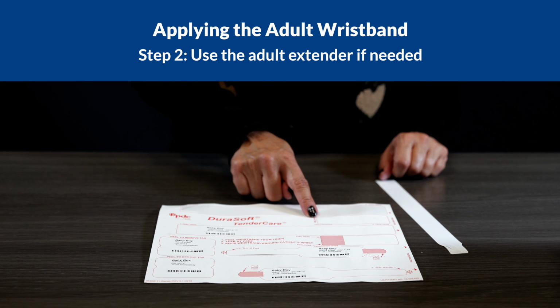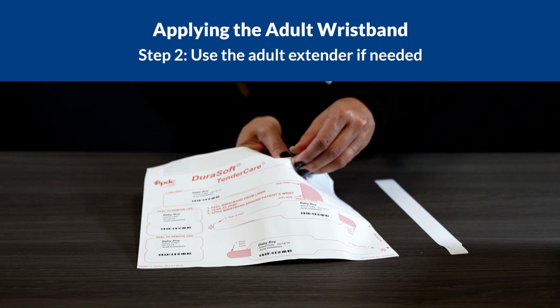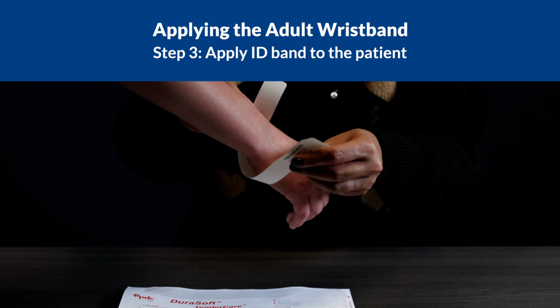For patients with larger wrists, you can use the extender to enlarge the wristband. Simply peel the adult extender off the sheet and apply it to the end of the wristband. Then apply the ID band to the patient.